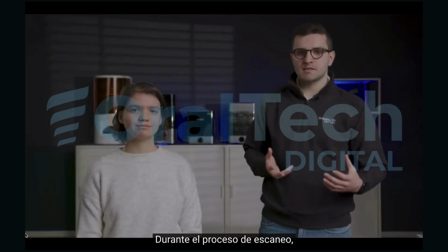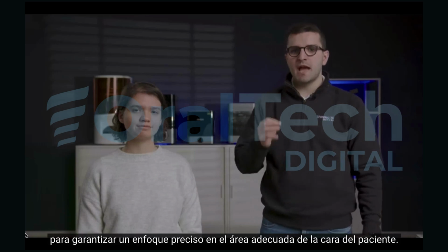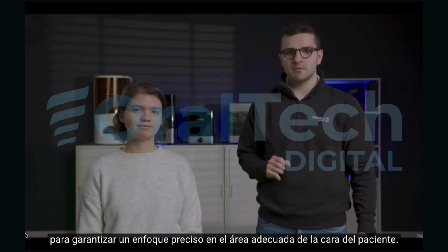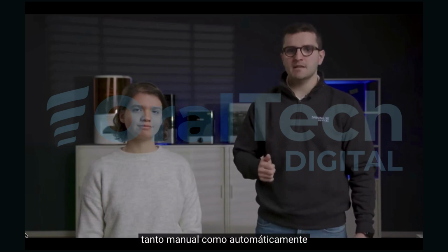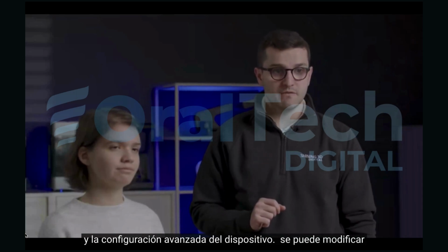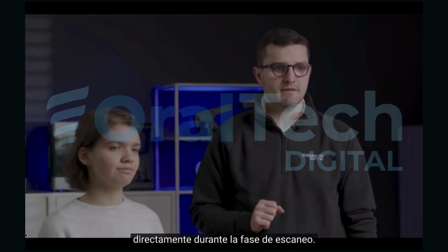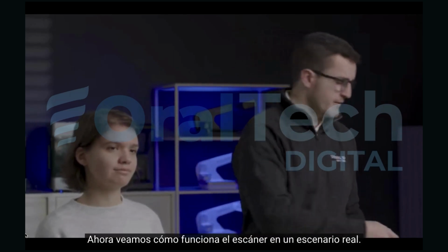During the scanning process, a proximity bar is displayed on the screen to ensure accurate focusing on the suitable area of the patient's face. In addition, the brightness can be adjusted both manually and automatically, and advanced device settings can be modified directly during the scan phase. Now, let's see how the scanner performs in a real scenario.